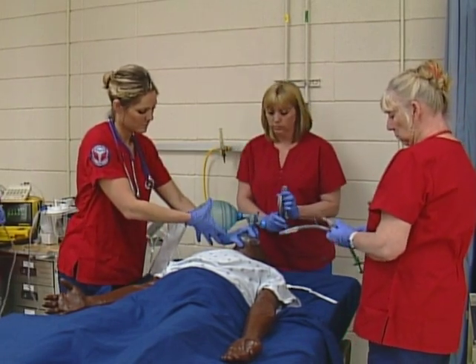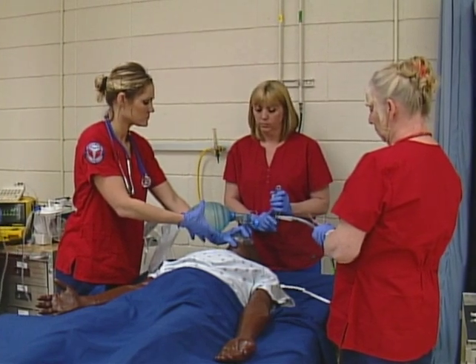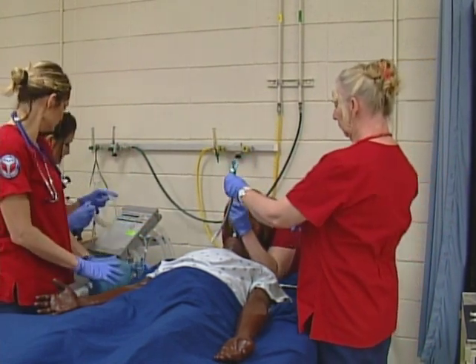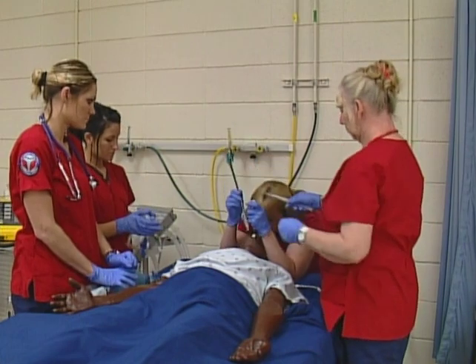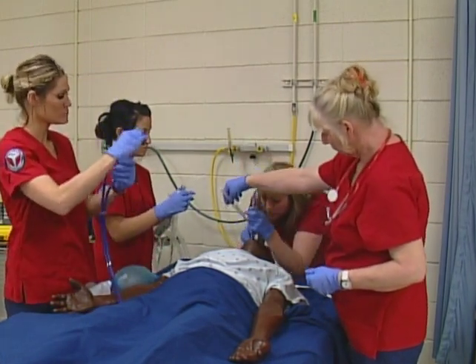Nancy's getting ready to inspect the patient's oral cavity with a lighted laryngoscope. Ready? Yes. She's looking for a couple landmarks to insert that ET tube, the artificial airway. Beverly hands the tube. Nancy's preparing to insert it into the patient's trachea.